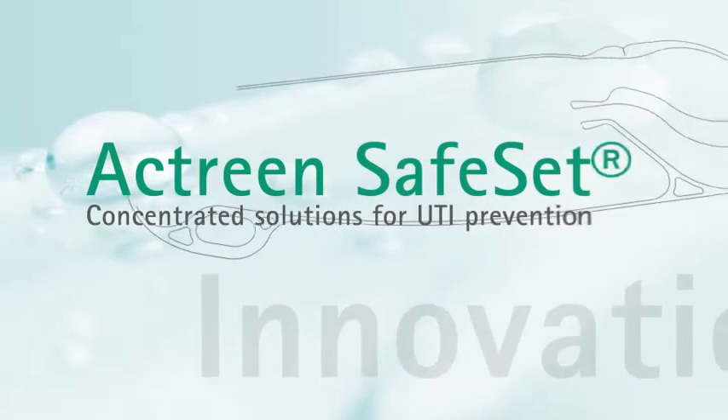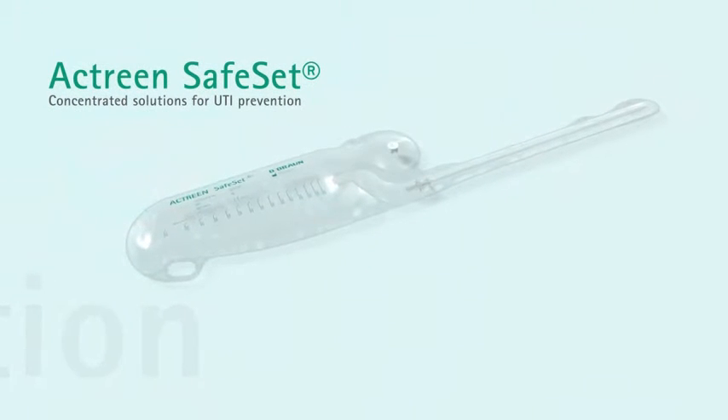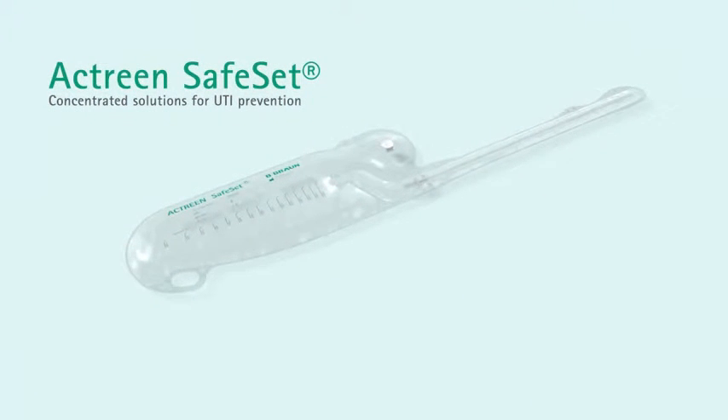Actrine Safe Set is an innovative set for single catheterisation in hospital with an integrated urine analysis sample port.